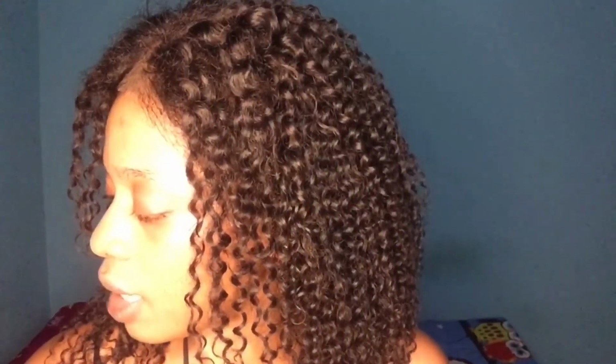Like I said earlier, you have to wash your hands with toilet soap before wearing your contact lenses, but as much as I've already washed my hands with toilet soap before handling this, I'm still going to rinse my fingertips with this solution before wearing my contact lenses, because I told you guys earlier I prefer using my fingers to wear it. I prefer it to that holder. After doing that, then I will wear it. So I will use this tweezer to bring out the lens.